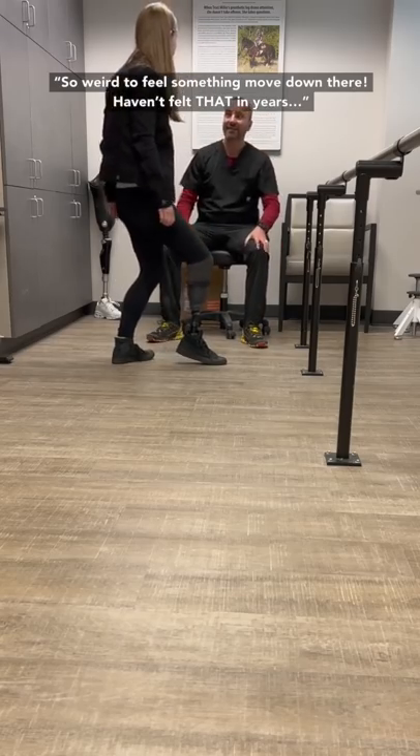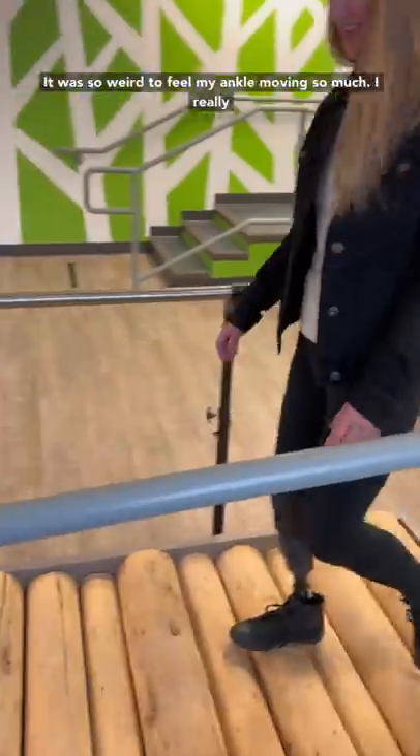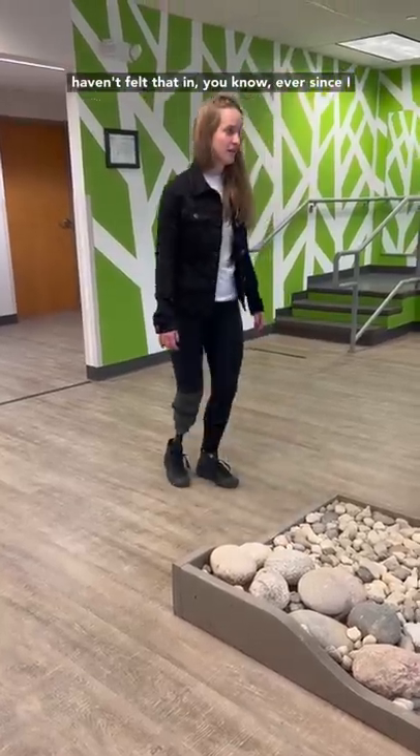It's so weird to feel something move down there. Haven't had that in like, you know, four years. It was so weird to feel my ankle moving so much — I really haven't felt that ever since I lost my leg.